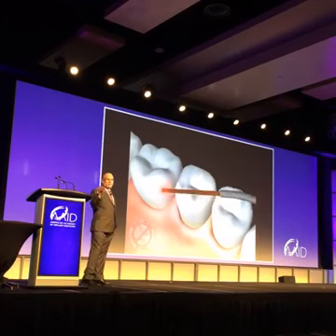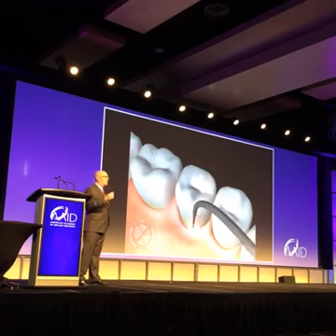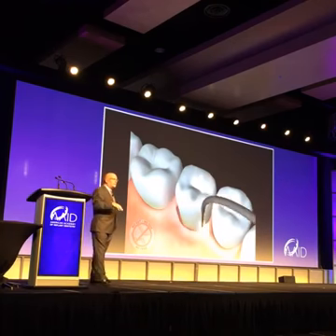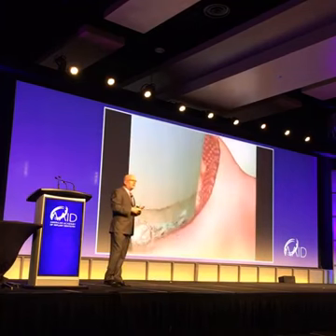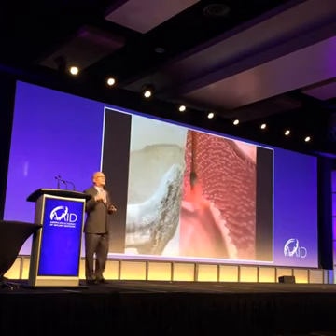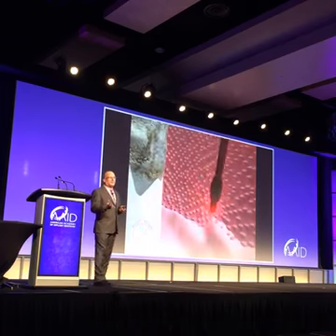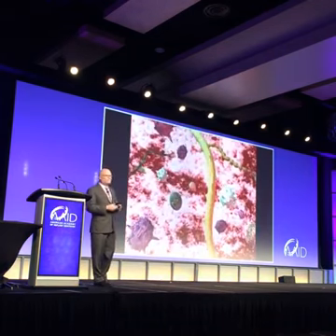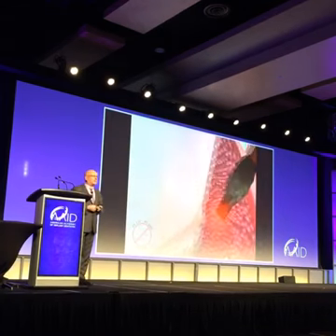This is just a little animation, and the reason I'm showing this is because this is kind of what we do in the mouth with the LAPIP procedure for implants. We use a laser to open up the tissue. We're getting rid of diseased epithelium, diseased tissue. We're killing bacteria. We're not cutting away the tissue that's not diseased. The disease for periodontal disease is on the inside, not the outside of the pocket, so we don't have to amputate tissue away. We're killing bacteria at the same time, like I said. Don't forget, it's past the point of contact.